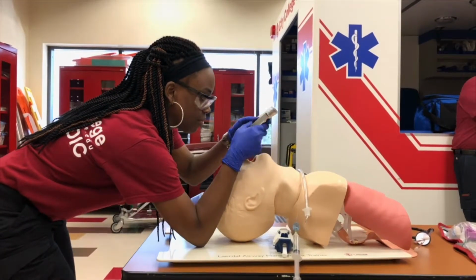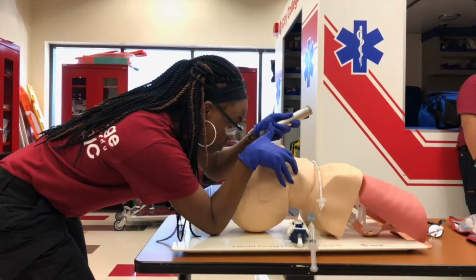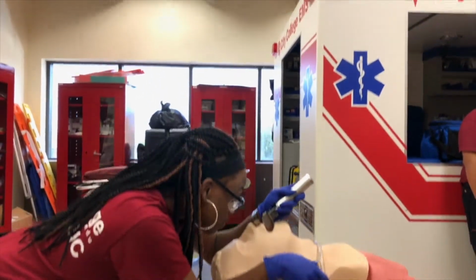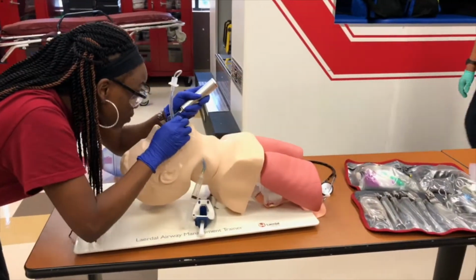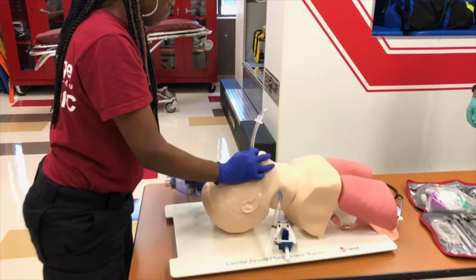Next, she's going to grab the laryngoscope with a MAC 3 blade, insert it into the mouth, pushing forward to visualize the vocal cords and expose the trachea. She's going to grab the ET tube now, place it into the mouth, ensuring that she does not go too far and stopping when she reaches the vocal cords.